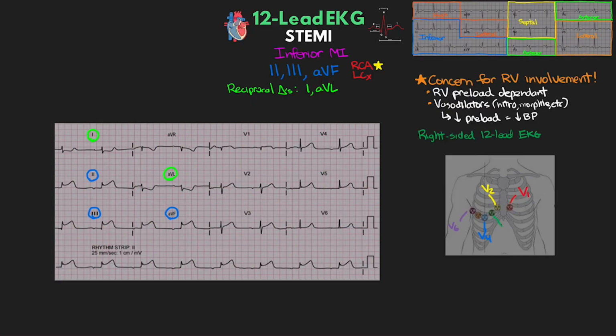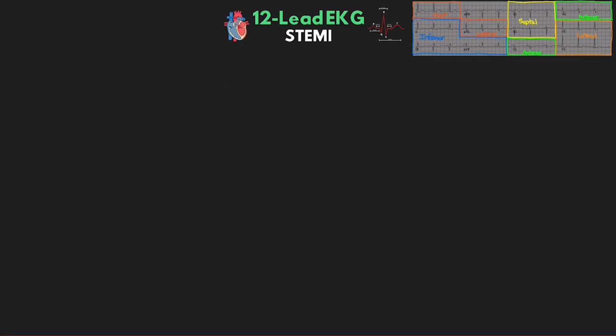And then V3, we want to put diagonally in between V2 and V4. And V5 is going to be in the middle of V4 and V6, again along that horizontal plane. This is going to give us a view of the right ventricle and really help us identify any RV involvement and determine whether the patient should be considered for sublingual nitro, or whether we also want to be concerned with morphine administration as well.